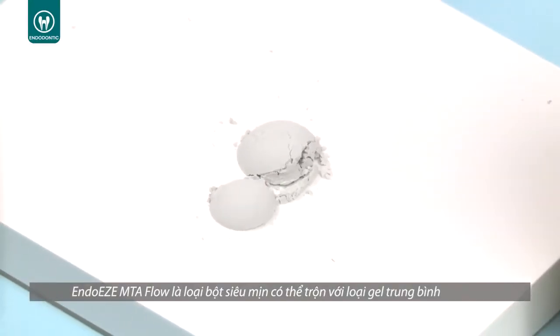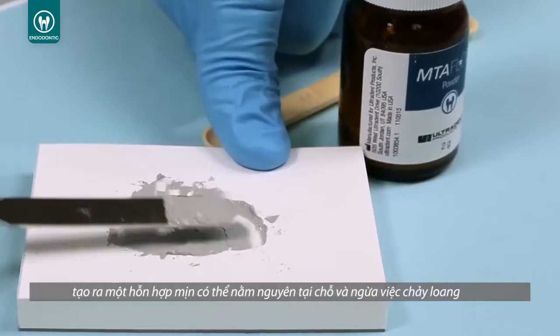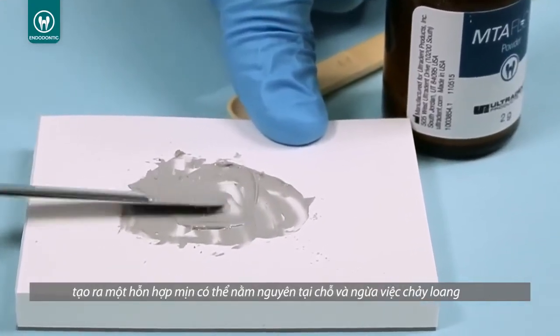The EndoEase MTA Flow Ultrafine Powder and Proprietary Gel Medium creates a smooth consistency which stays in place and helps prevent washout.